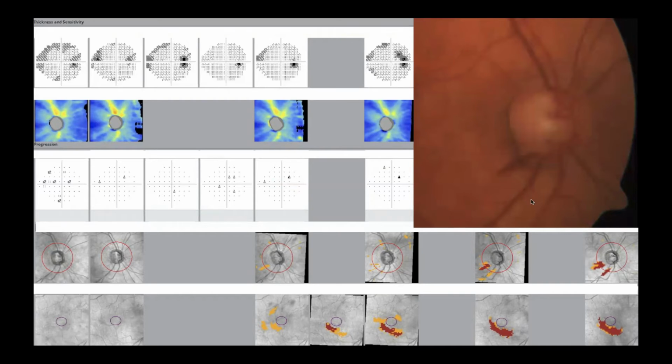We have a picture of that Drance hemorrhage back. And then you can see overall the ganglion cell analysis, we have that thinning in the macular vulnerability zone over time as well. So these are really important things to keep in mind when we're monitoring our patients and utilizing Forum to really get a good picture of what's gone on with our patients.